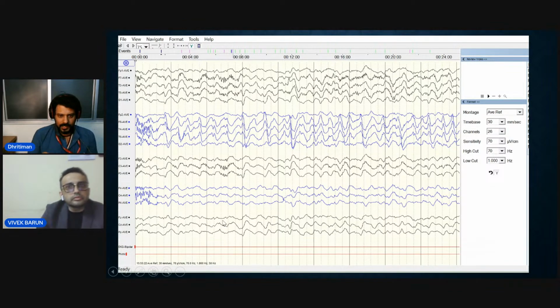Beyond this, one more thing that came to my mind was about the montages. What are the common montages for seizure detection which are used in the ICU? And what is the purpose of bipolar or common average? What is the purpose of each of them? Yes, sir. So normally, whenever we are reviewing EEG, we should use at least two montages.